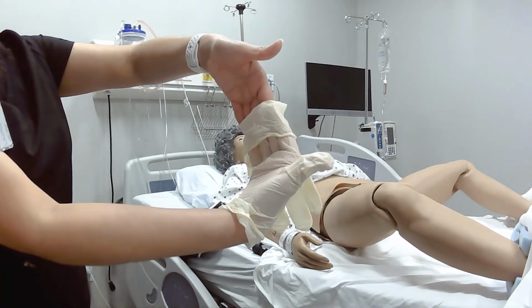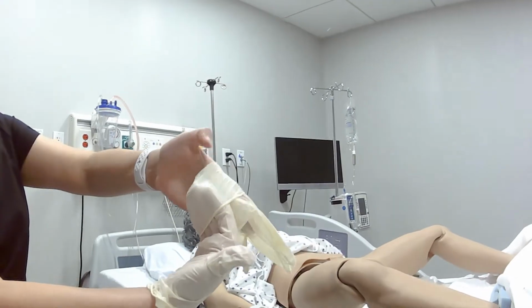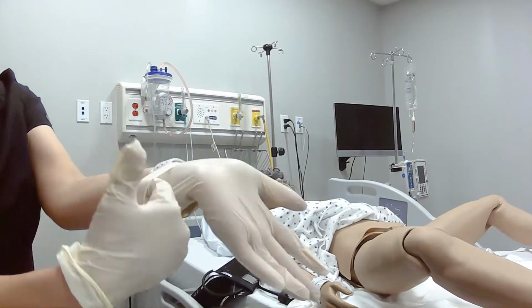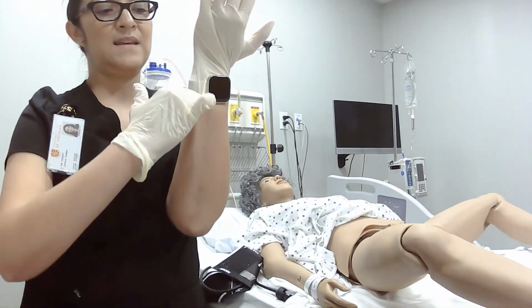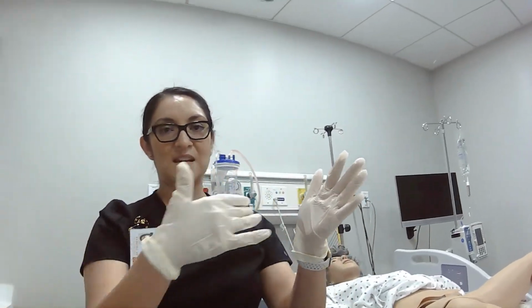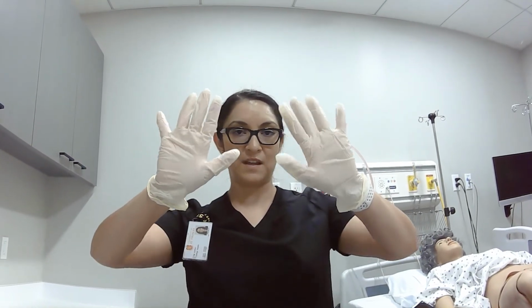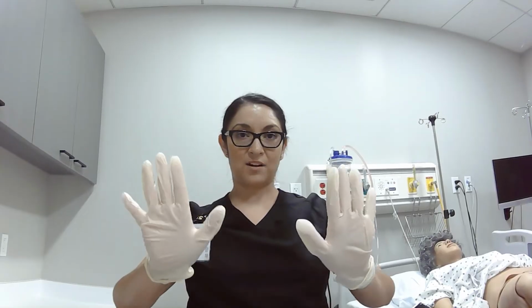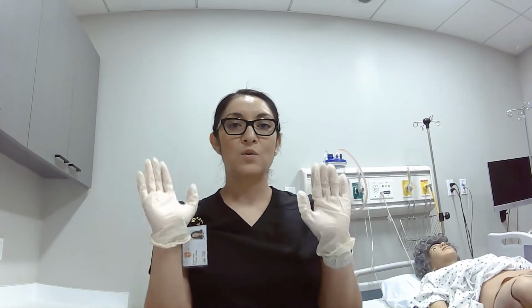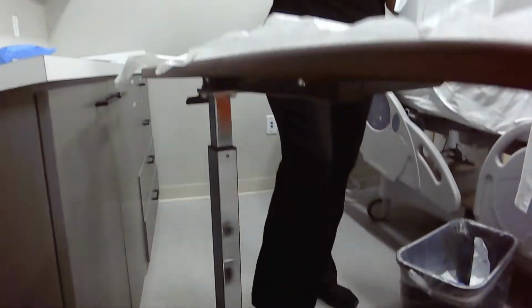So then now I'm going to slide my left hand, so the thumb is going to be on this side, so I keep my thumb on this side, and it's going to slide right in, okay? And as I'm placing the rest of the glove on, I'm making sure that my hands are staying inside or touching just the exterior of the glove, okay? So now I am completely sterile. I cannot touch the bed, I cannot touch the table with my sterile hands. So I'm gonna have to use my feet a lot in order to adjust, okay?